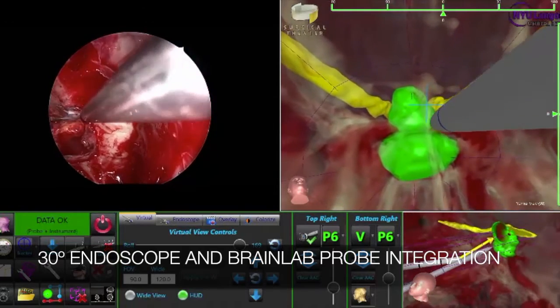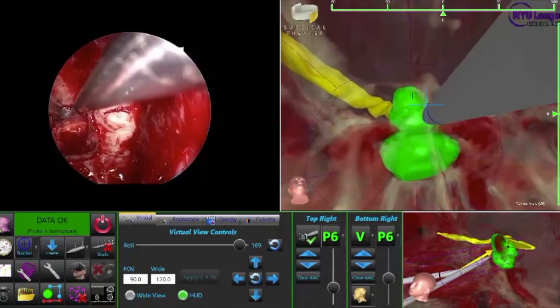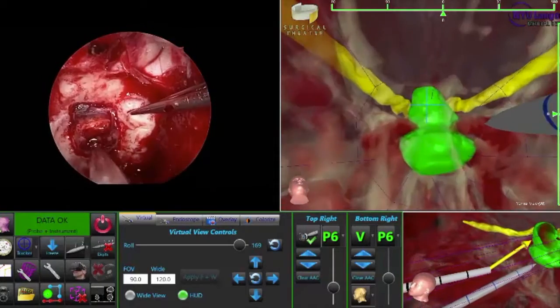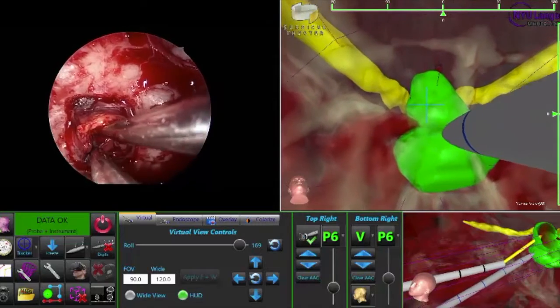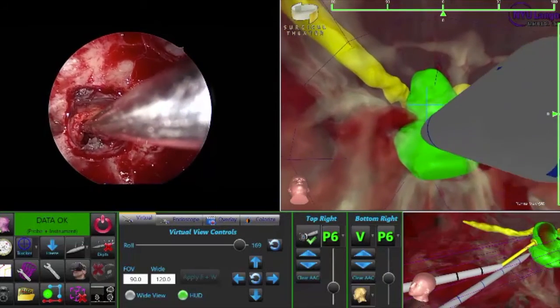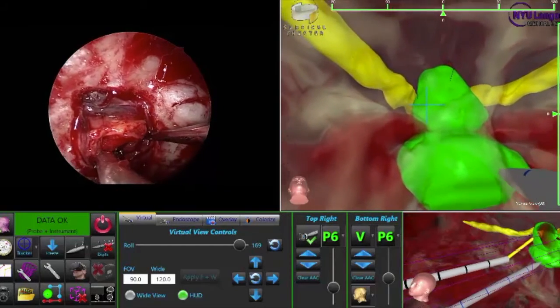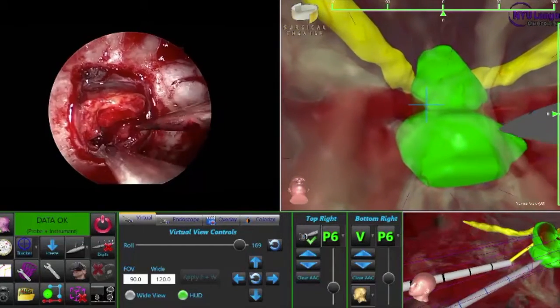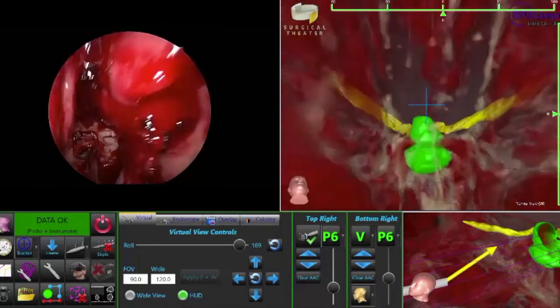And here we're checking again using endosnap and neuronavigation that anterior knob that went over the tuberculum sella, and we want to make sure that it had descended and had been removed. And that was indeed the case. So the tissue that you see now is normal pituitary gland that has descended into our field because we have removed the entire hemorrhage and the apoplectic tissue.